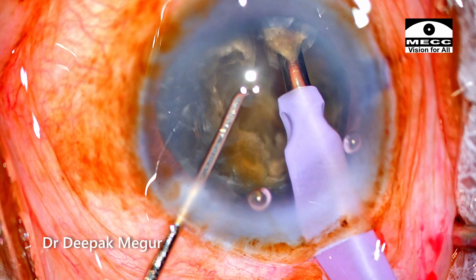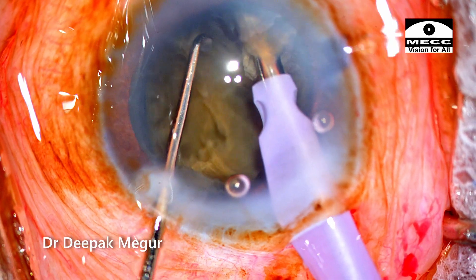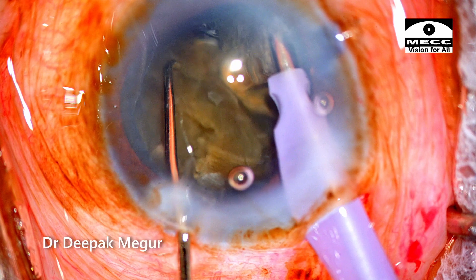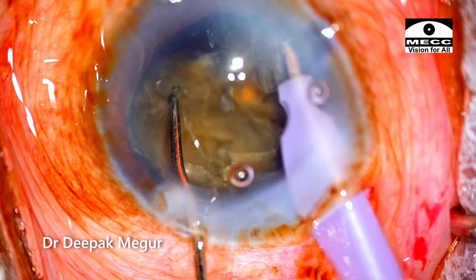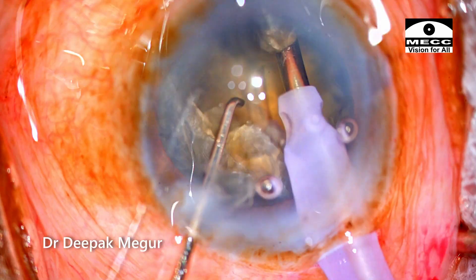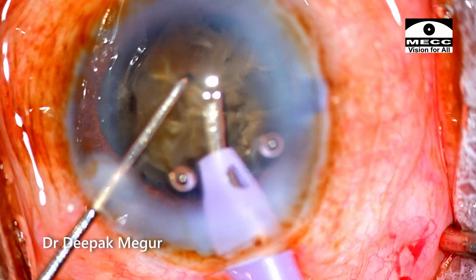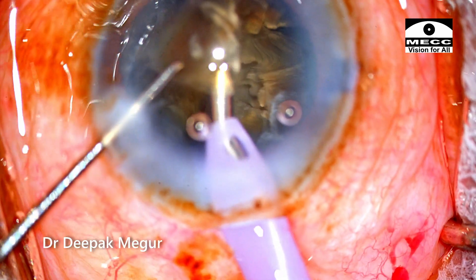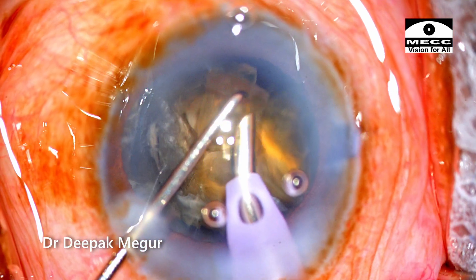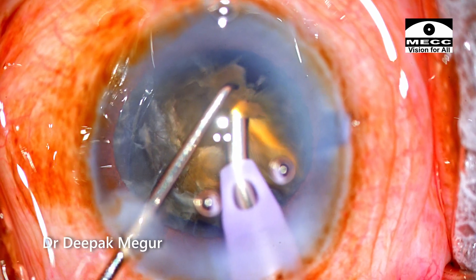The process of dividing the nucleus and trying to separate the posterior plate continues. As soon as I have a small fragment I pull it out of the bag and emulsify it at the level of the rhexis. When emulsifying, please note the position of the bevel — it is slanted slightly downwards and toward my left. Since the bevel is facing away from the endothelium, this prevents ultrasound energy from traversing toward the corneal endothelium.